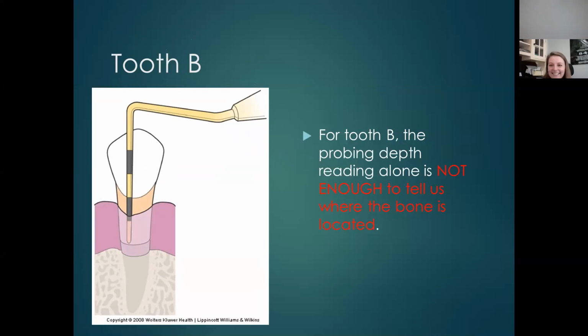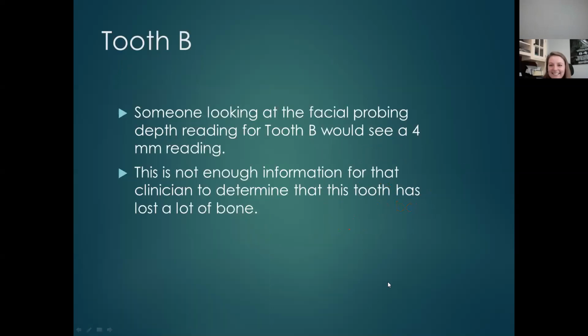And this is something that a lot of practices do. They just do the periodontal probing depths. They don't measure other things. It's one of my beefs with the restorative clinic too. You get a restorative clinic patient, the patient's paid $150 for a comprehensive exam, which is 4 horizontal bite wings, a panorex, maybe a couple periapicals. They have periodontal probing, which is just the periodontal probing, no gingival margin, mucogingival lines, anything like that, and then they get a treatment plan written up. Well, anyway, that's all I'm going to say about that.